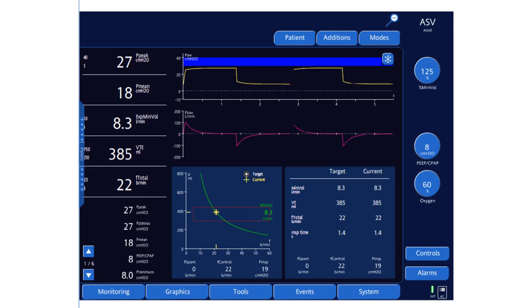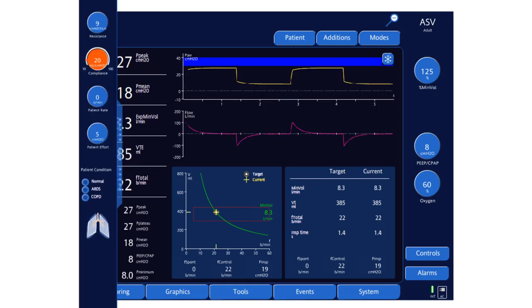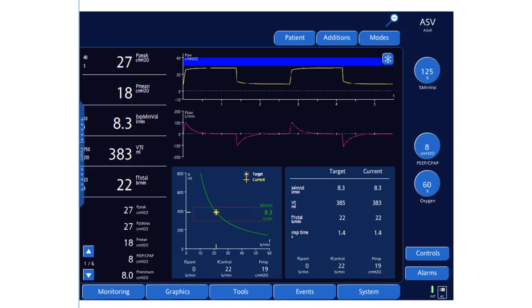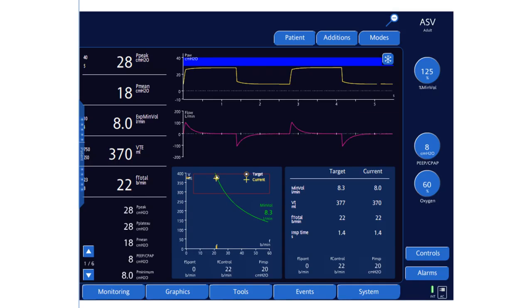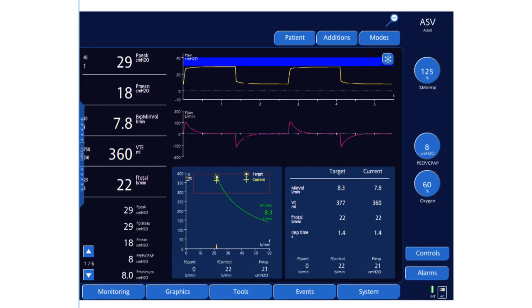Let's worsen compliance further to 18. At a compliance of 18, the expiratory time constant is recalculated. The new target is approximately 379 ml at 22 breaths per minute. The patient is below target, so pressure increases gradually from 19 to 21 cmH₂O to achieve that target, and you can see the minute ventilation gradually rising toward the target of 8.3 liters per minute.